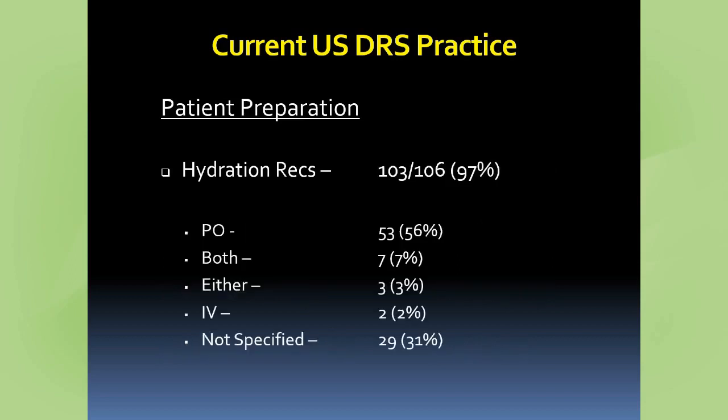So what are the hydration recommendations that people are doing out there? You can see there that the vast majority, over 50%, are using oral hydration. That's great. That's totally acceptable by guidelines. Unfortunately, about 1/3 are not really specifying. That's basically institutions that say, we recommend the patient be well hydrated prior to the exam. So it's likely that the vast majority of those are oral hydration. It's just not spelled out, but in practice, it's probably like that.